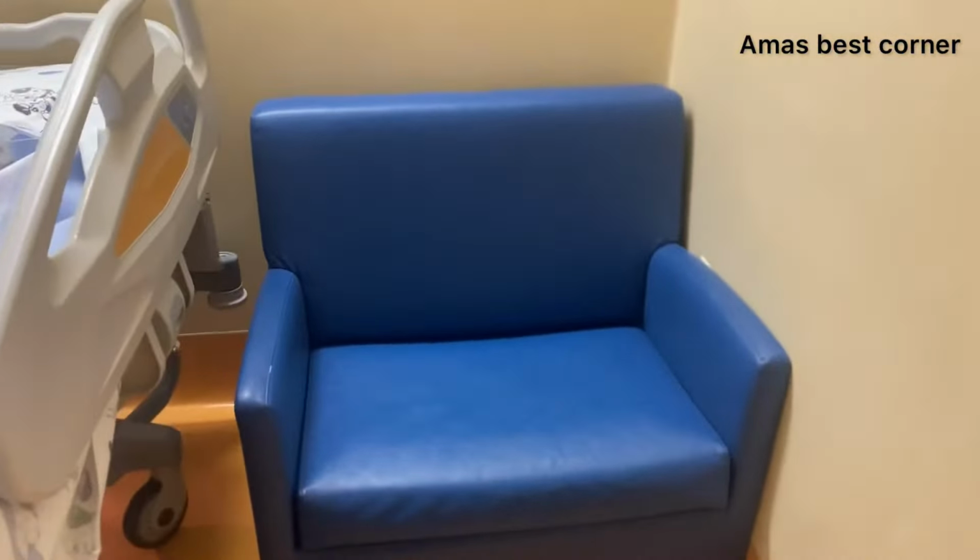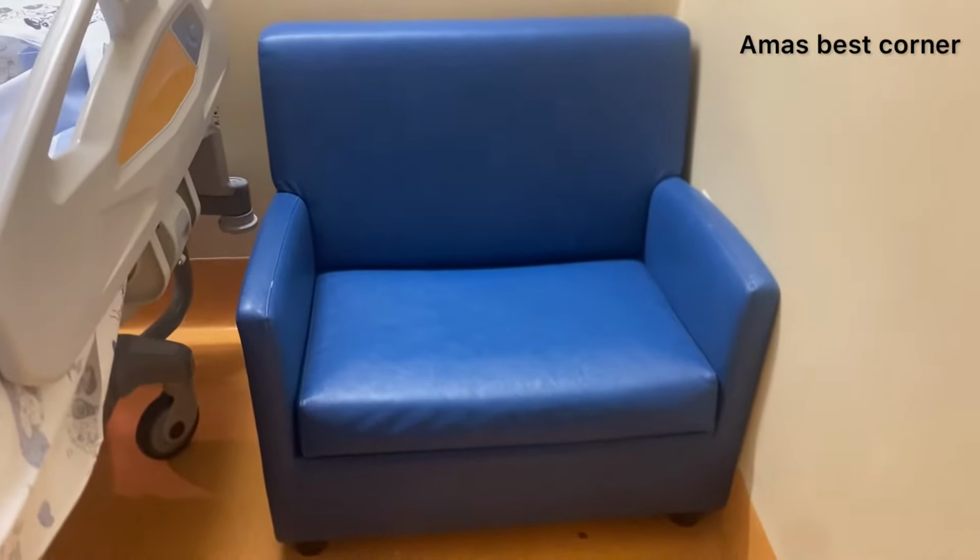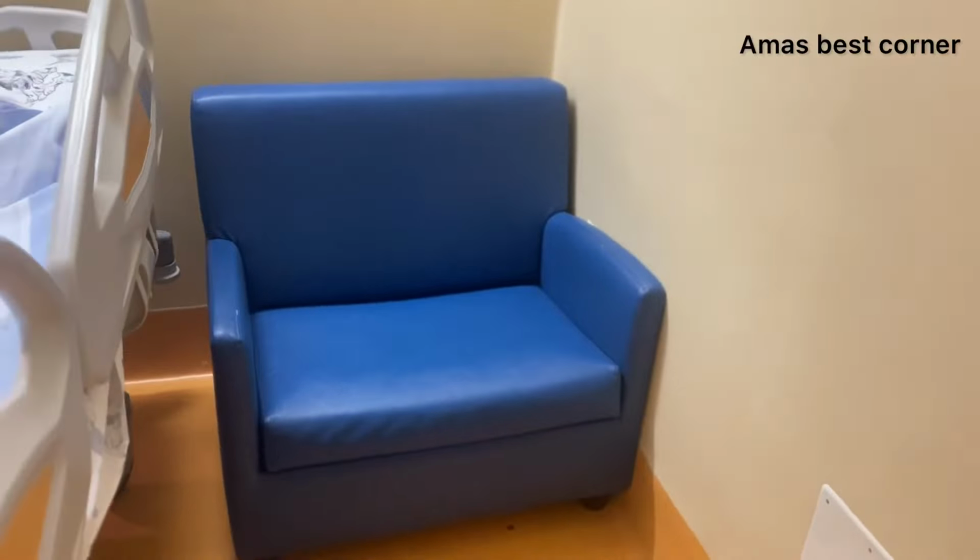This chair has a foam bed in the chair. You can open it and it turns to a foam. Maybe you have a visitor, the person wants to sleep there, then you can sleep there.